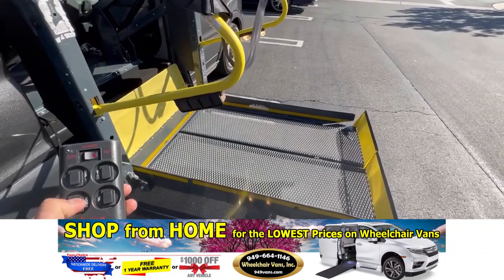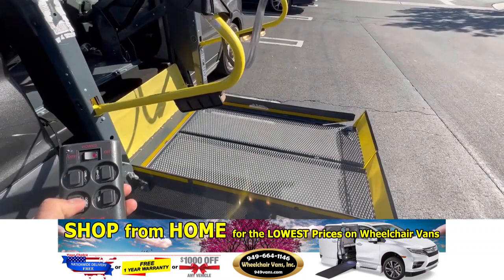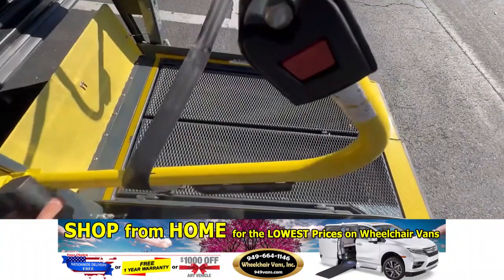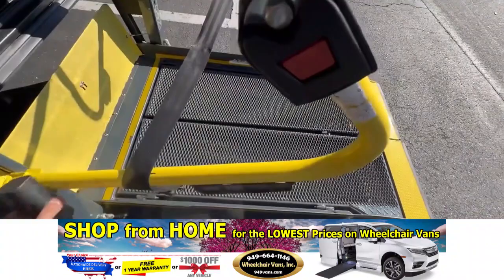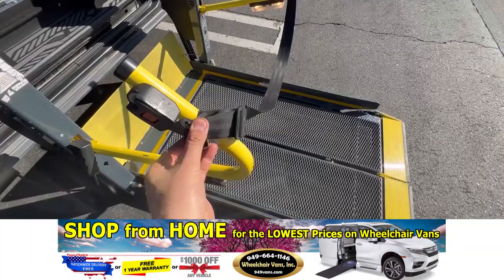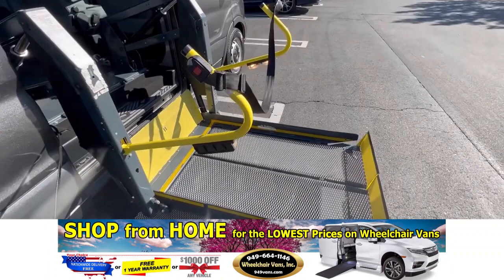Hit down to bring the lift down. Also, if this buckle here is not plugged in, the lift will not operate. So as you're loading and unloading passengers, if this is not plugged in and you try to use it, no matter which button you press it will not work. Once you have the seat belt plugged back in, it'll start operating again. Hit up to bring the lift up.